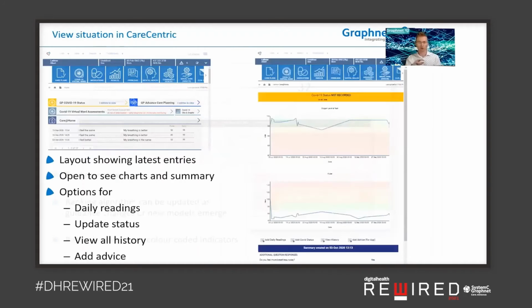They would launch the shared record view directly from that dashboard. From there, they would see the alerts and the rest of the shared record as normal. But in this case, in this area, they've labeled the care at home module. They can then go in and see that additional detail that's been entered by both the patient and their colleagues in the care team.